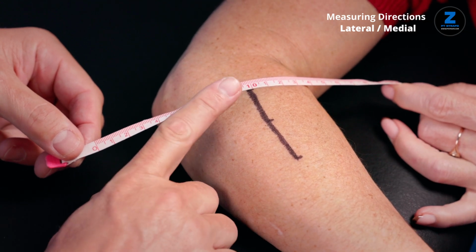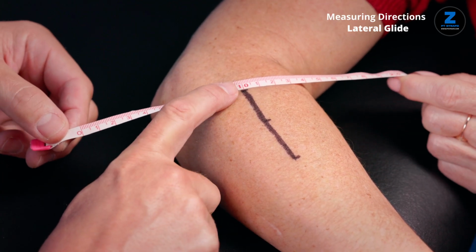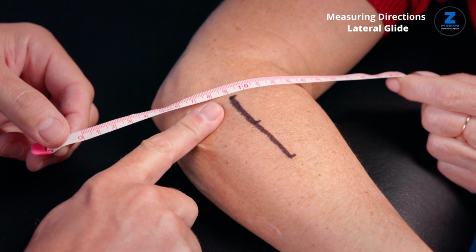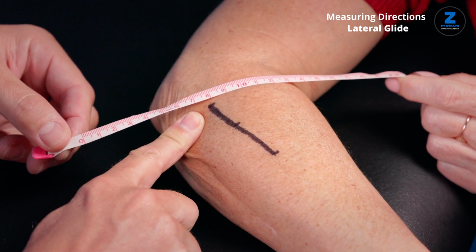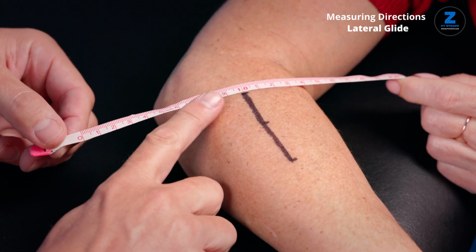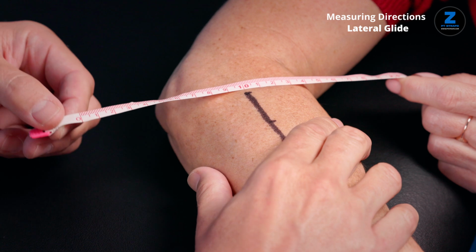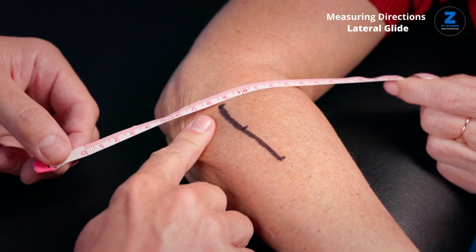So I'm going to hold, and then I'm just going to pull the skin over laterally to see how far the very superior aspect of the scar moves, and see how it simply pulls 2 centimeters over. All right, so from 10 to 8 to 2. So I would say that's a 2 lateral excursion, 2 centimeters.